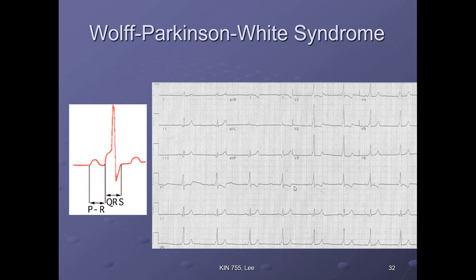If you look at a 12 lead with it, it's not discernible in all of these leads, but there's definitely a few, like here, V1, V2, V3, you're seeing that delta wave, also V4, V5, V6. Maybe a little bit. Also in, well, not really, I don't really see it too much in lead 2. So it's mainly in the precordial leads in this 12 lead that you can actually see the delta wave.